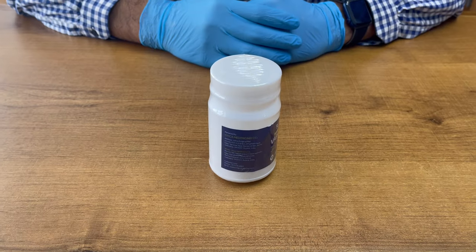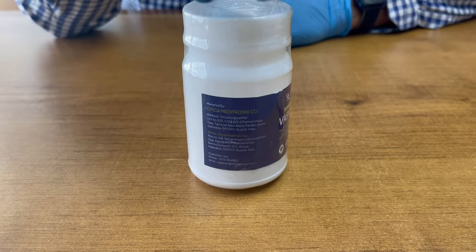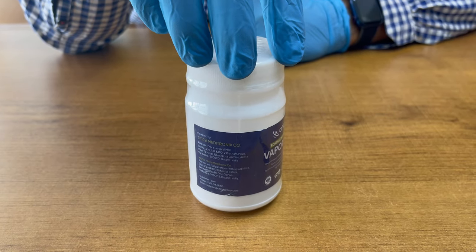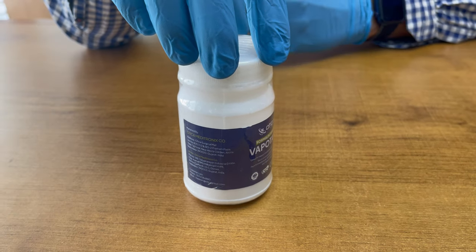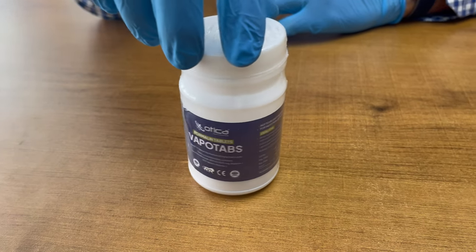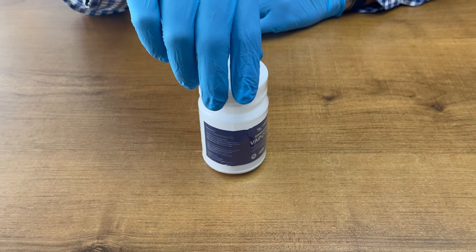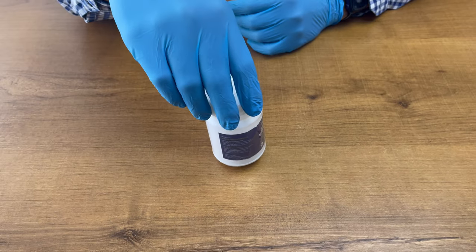Hello friends, welcome to Otica Meditronics Company. Today we are going to demonstrate an unboxing of Otica Med Vapotabs — a vaporizing tablet made with formalin to sterilize surgical instruments and basic hospital equipment. This is the best product for sterilization with formaldehyde, and it comes in tablet form for medical use.